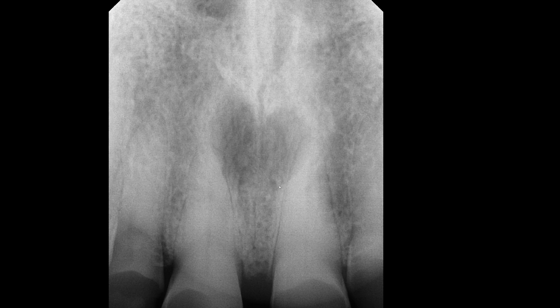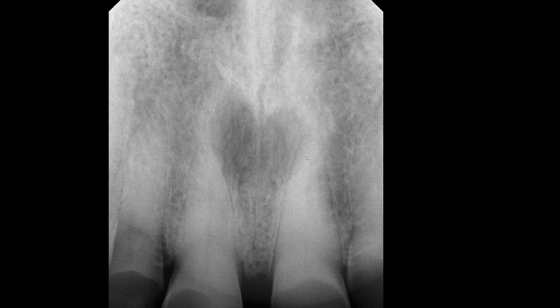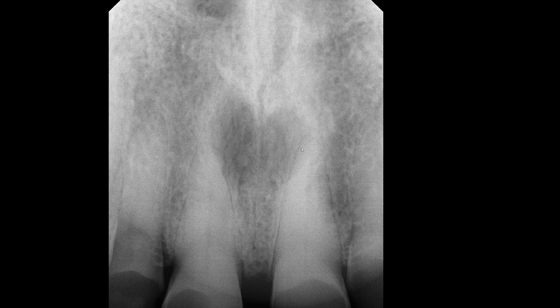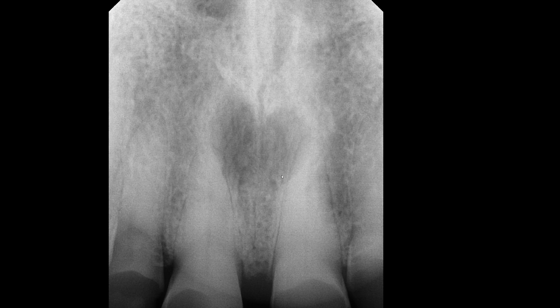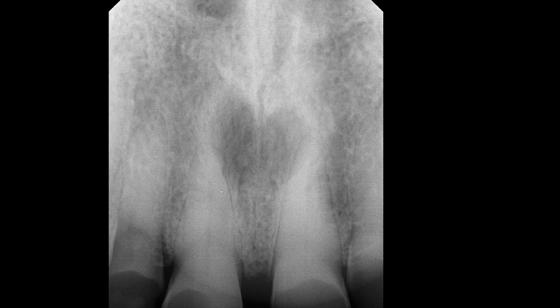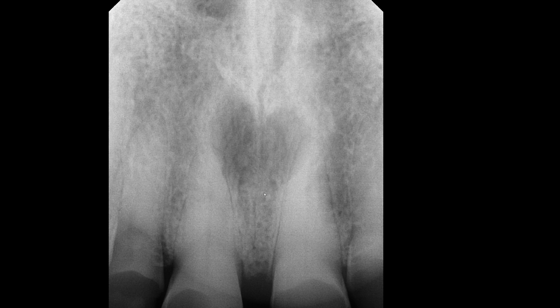If you have a single radiograph, we certainly cannot answer that. What I see is that part of this radiolucency is superimposed or overlaps with the apex of number 8, and that's really all I can say. However, when we have a series of radiographs with the location of the tube being shifted, we are able to determine the location of that radiolucency.